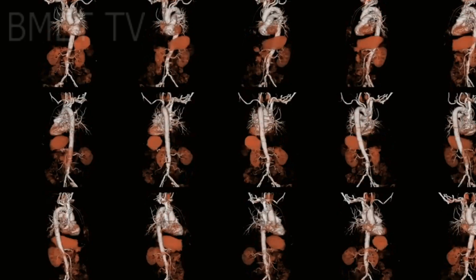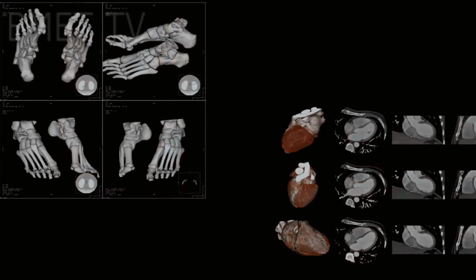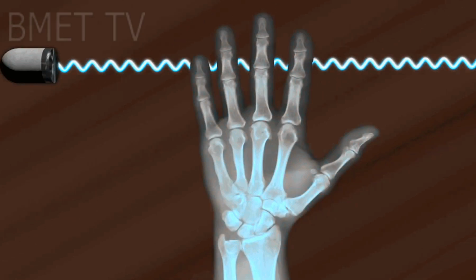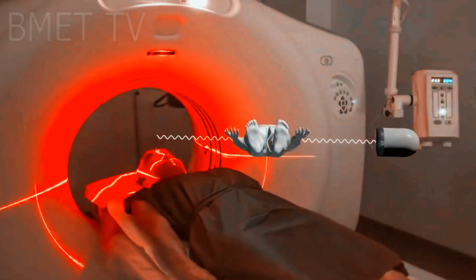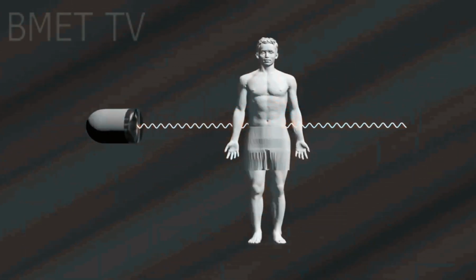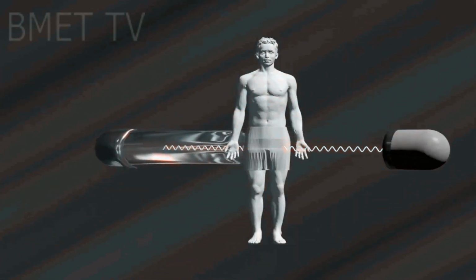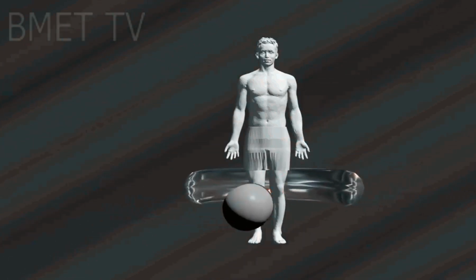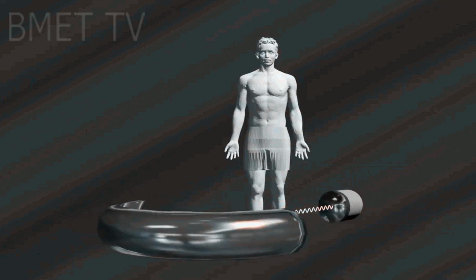The second type of CT scanner is single-slice CT machines. Single-slice CT machines are capable of acquiring one image per gantry rotation. The gantry is the ring the patient is placed in. A scanner with more slices allows faster acquisition. For example, a multi-slice would make it easier to examine unruly children or weak elderly patients that can't lie still for too long. While multi-slice CT machines have become the industry norm, the single-slice machines are still useful components and should continue to be around for quite some time.